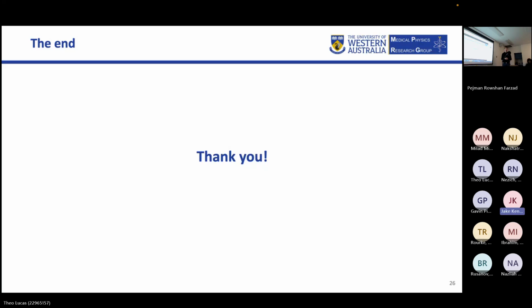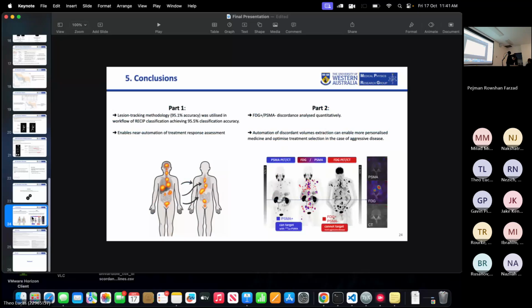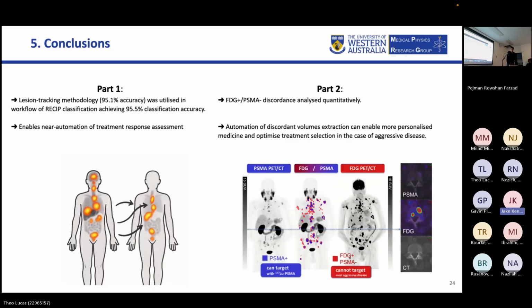Quick question. Can I go to slide 24? I saw the picture and I was wondering, if a patient has a small region with a really high density of small lesions, is the dilation method you mentioned before still working? If we apply the dilation to small lesions really close to each other, are they going to connect with one another and cause degradation, impacting the performance of the algorithm?